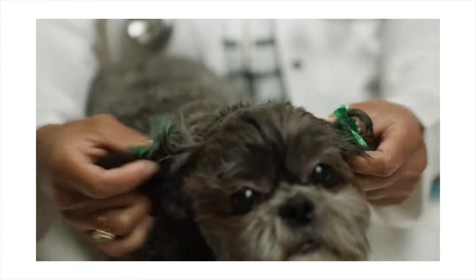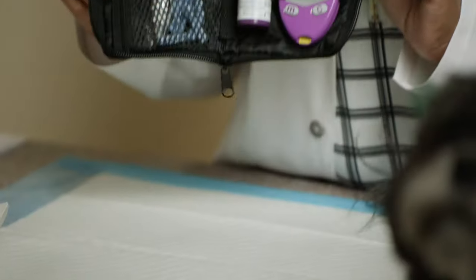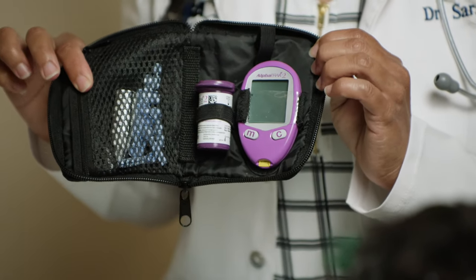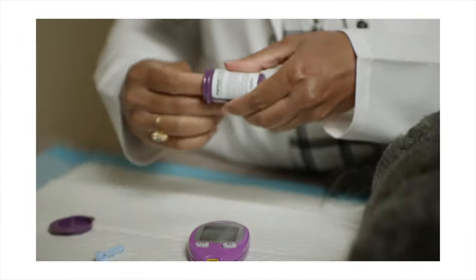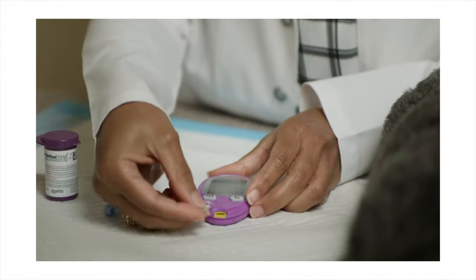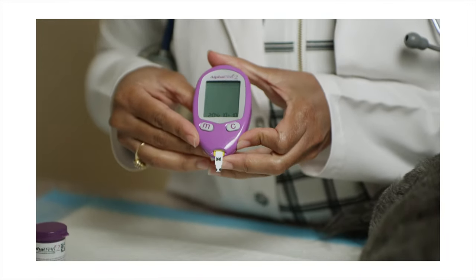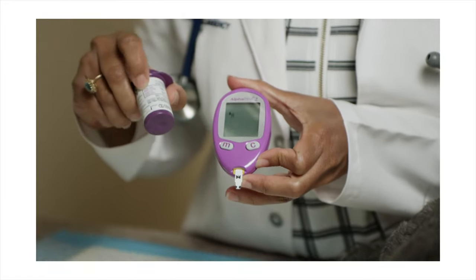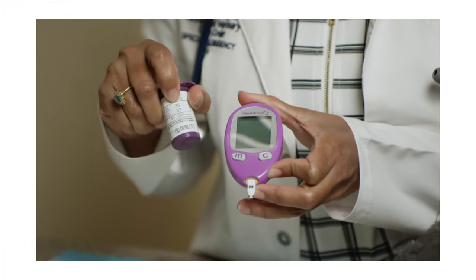So for Izzy, I think the best location to collect that sample would be from the inside of her ear. We're going to use the glucometer to test her blood sample for her blood sugar levels. We're going to remove a lancet from the little pouch, take out a test strip, and insert it into the glucometer. You'll see a number pop up on the screen and you want to make sure that it matches your species — a pet, in this case a dog, which is the number 35.